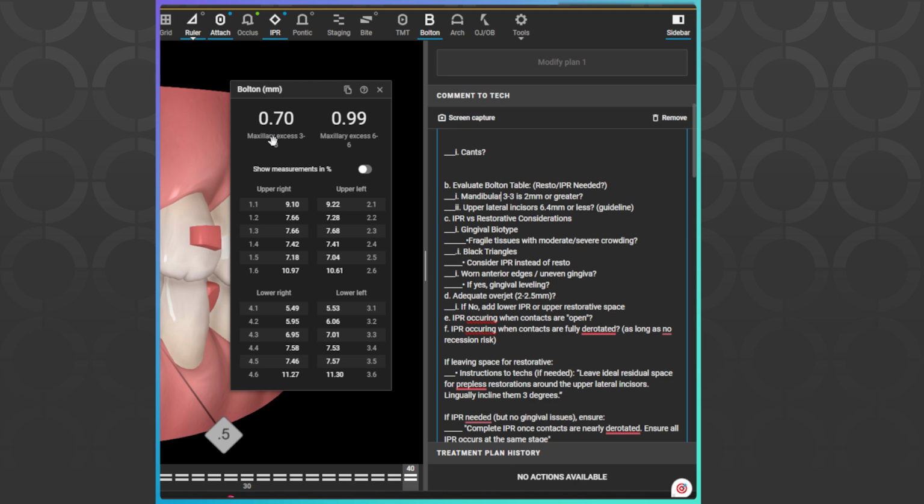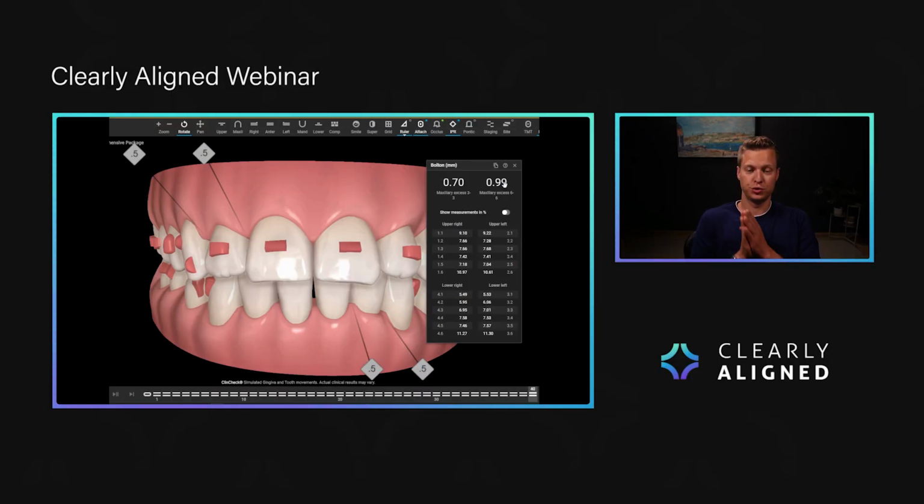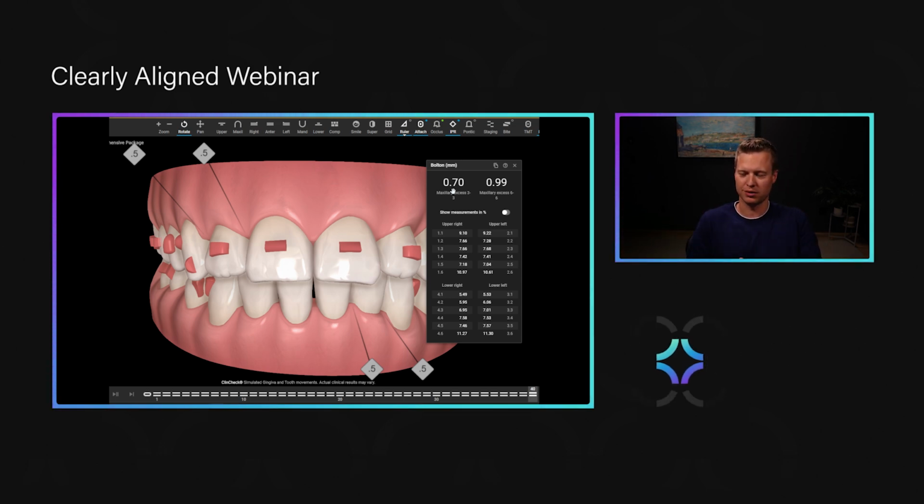of 0.7 millimeters between the canine to canine region, or about 1 millimeter between the first molars. Now, a Bolton really only becomes relevant when the Bolton is going to be more than 2 millimeters. So let's say you had a mandibular excess right here, and the number it gave you was 1 millimeter. Who cares? Doesn't matter. It's not clinically relevant. It's only if it's 2 millimeters or more for a Bolton discrepancy, either canine to canine or first molar to first molar, that a Bolton needs to be changed by doing IPR or by doing restorative.